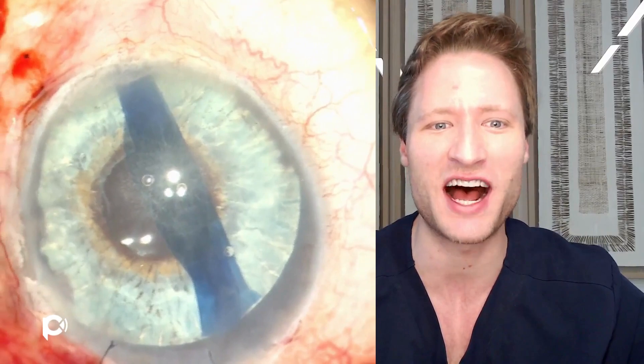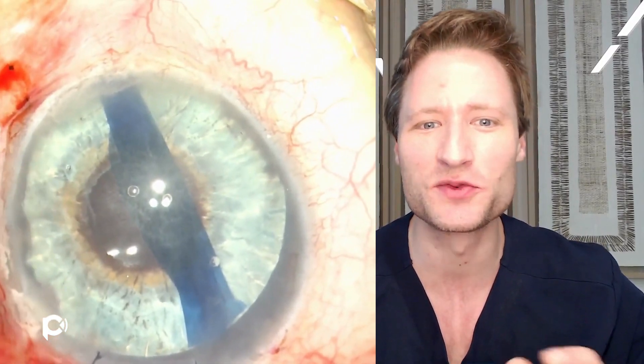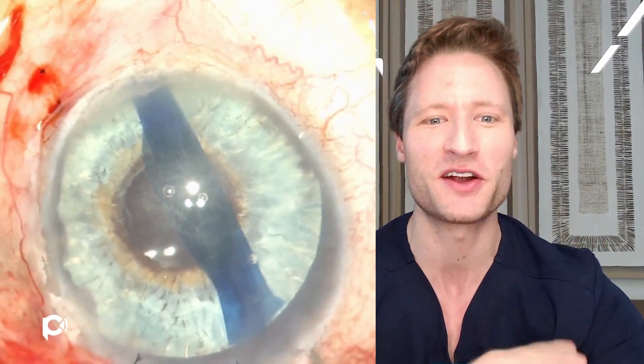Relatively recently we did one of these cases, and I wanted to show the video to demonstrate how simple and straightforward these cases can really be. This is an eye that has had a tube shunt and an artificial iris placed for aniridia secondary to ICE syndrome, and you can see the rudimentary iris stump there in the periphery.